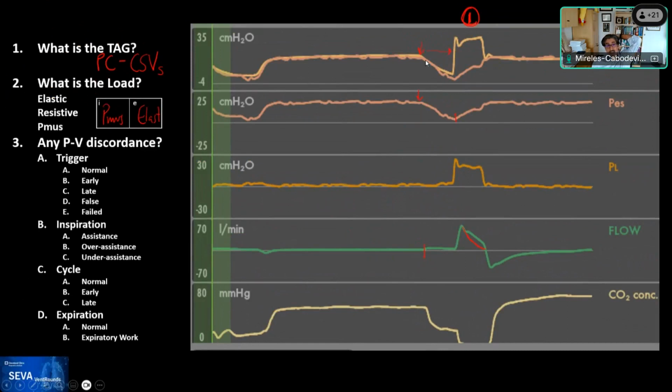You usually don't get all these signals at the same time. Remember, during exhalation, you're controlling the pressure. So it's rare now to see these drops unless you have done something. And I'm going to ask you what you see there. And then you have here the esophageal pressure, the flow signal, and the end-tidal CO2 all showing the exact same thing. Very good.